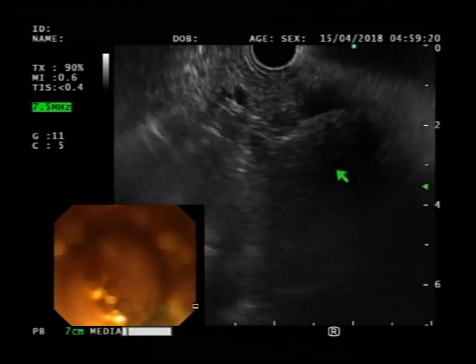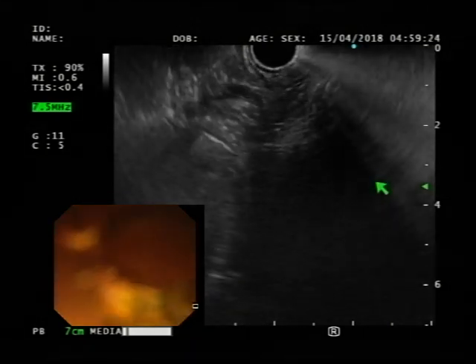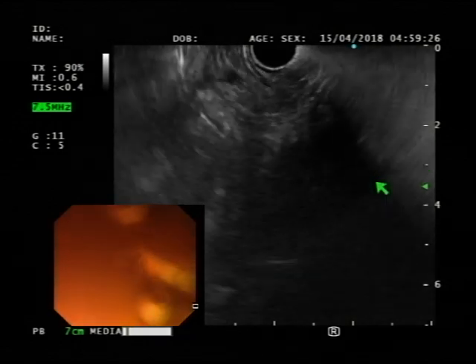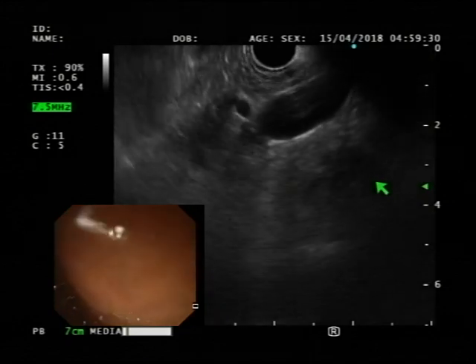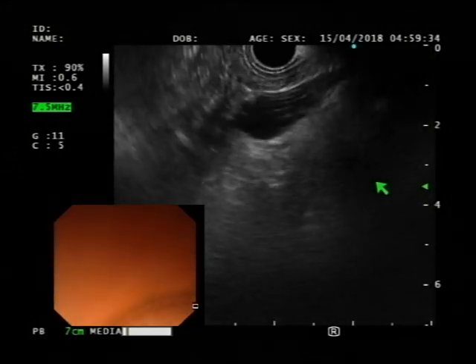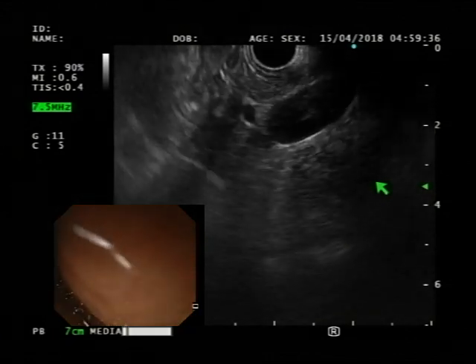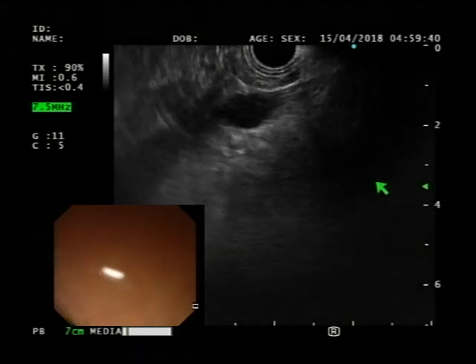And the pancreatic head would be down here in this view, right there. So just spin over that area. There you go. Okay. So that's the confluence. Yes, that's part of the confluence. We're not seeing all three vessels, but you're on that same track.